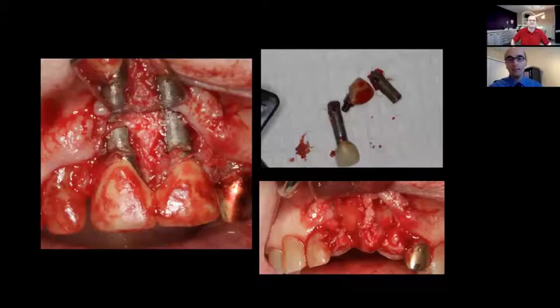And well, I wasn't very confident to do bone grafting around these implants because I didn't know the implant surface. I didn't know if this implant surface is amenable for regeneration. And as you see here, the bone loss goes all the way apical to the implant surface. So what we did with piezo surgery, ultrasonic, I made the trough and tried to remove these implants.